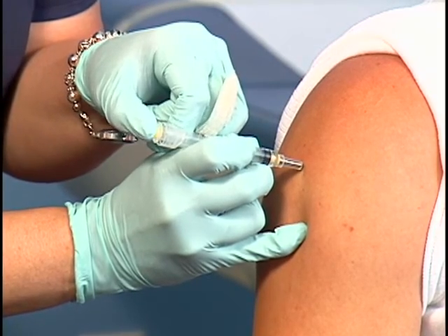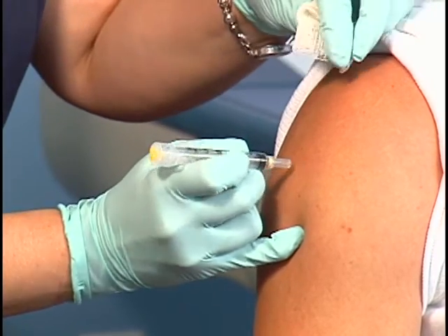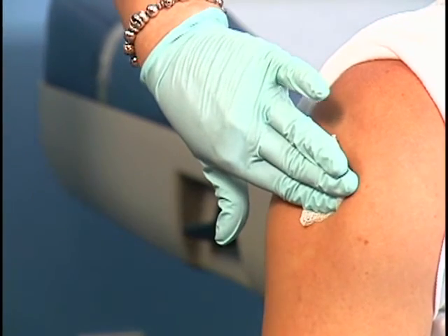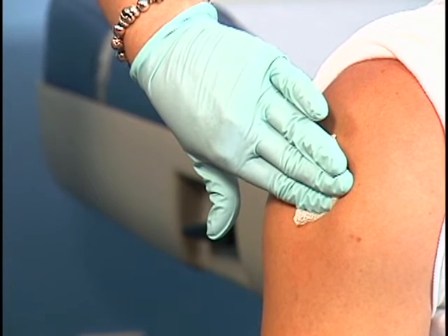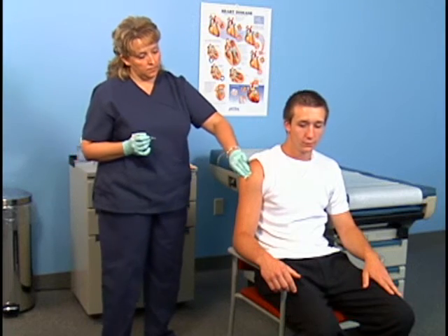Activate the retractable needle on the syringe by firmly depressing the end of the plunger. This causes the needle to automatically retract from the patient's tissue and into the syringe. Place a gauze pad over the injection site. Apply gentle pressure to the injection site with the gauze pad. Gentle pressure helps distribute the medication so that it is completely absorbed by the muscle tissue. Avoid vigorous massaging because it could damage underlying tissue.